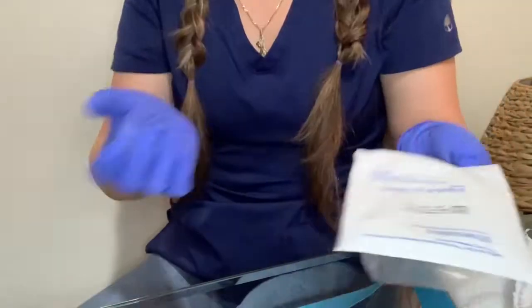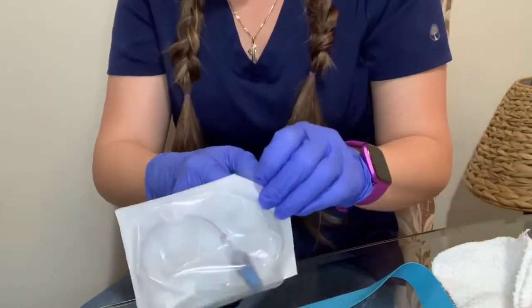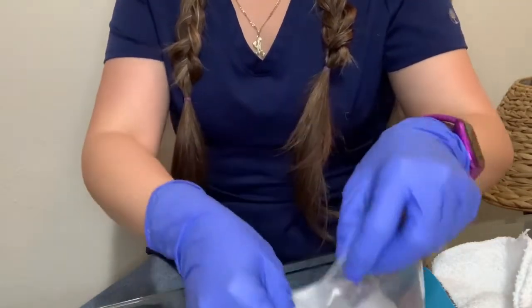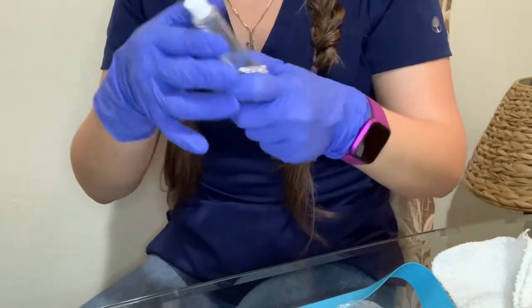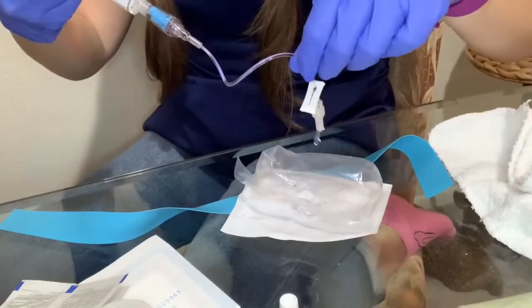The first thing I want to do is make sure that I prime the extension tubing. For that I'm gonna use the normal saline and run it through the tubing, as you can see.